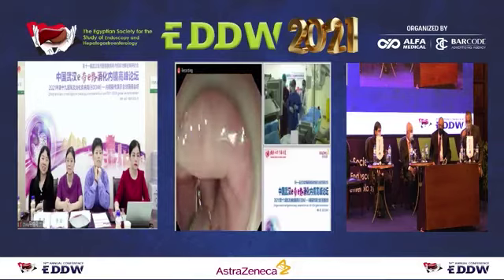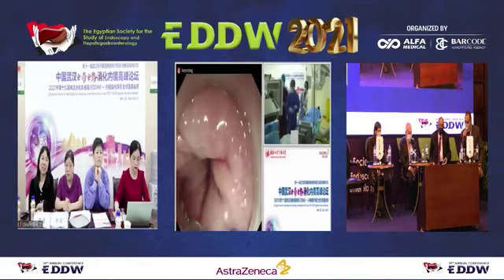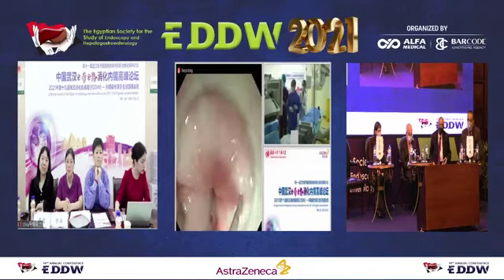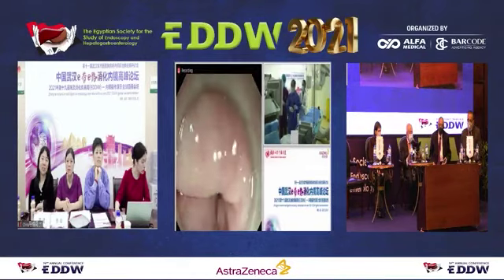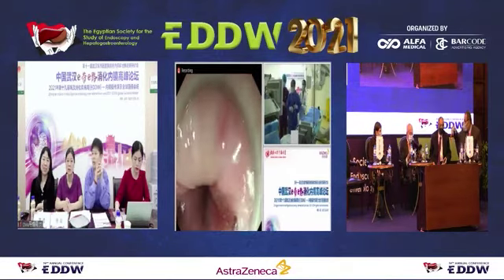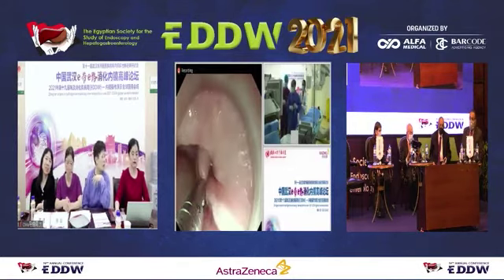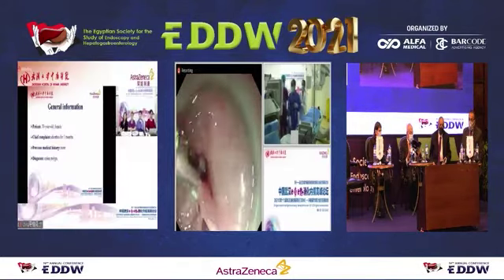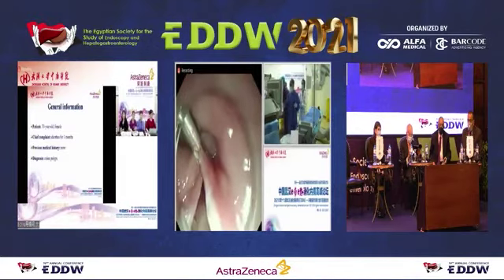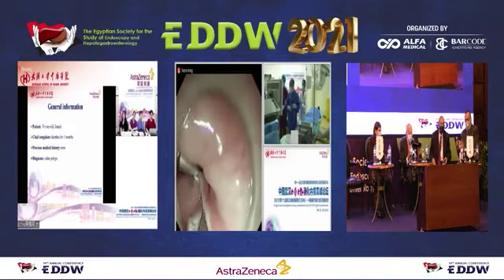Now we will use the clips to close the wound. Open, don't rush, young man, don't rush. Trying to do the closure of the track. You're closing with clips. Turn it a bit, don't rush. Okay, close a little, don't rush.